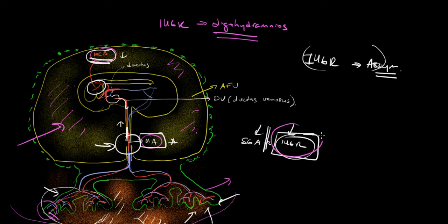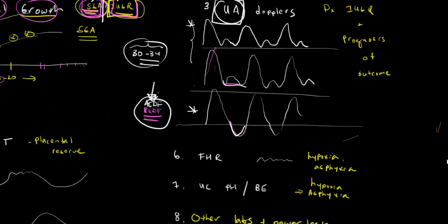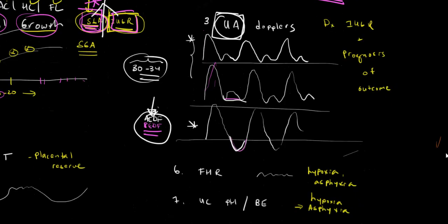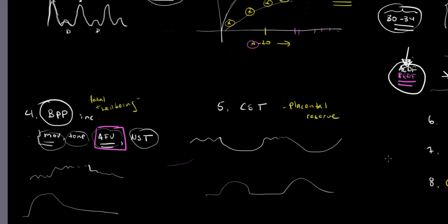The way they do it is the ultrasonographer looks and counts and sees the size of these amniotic fluid pockets that they can find, pure amniotic fluid pockets without any fetal parts intruding into them. So that is part of what's called the biophysical profile. Now, the last part of the biophysical profile is something called a non-stress test. And I'm going to simplify this.